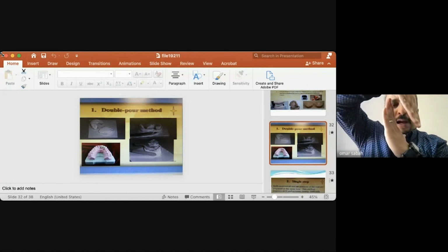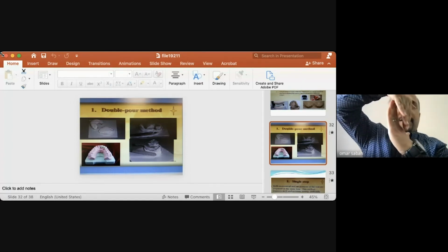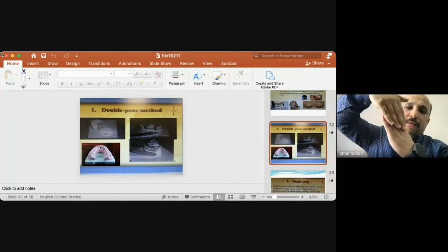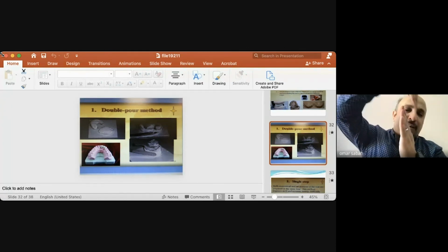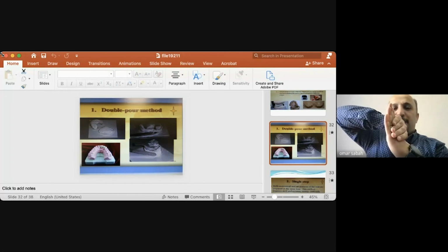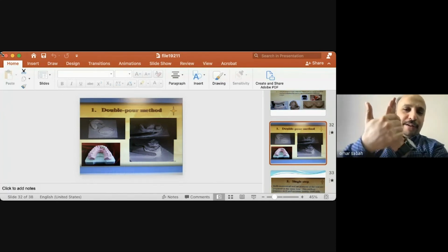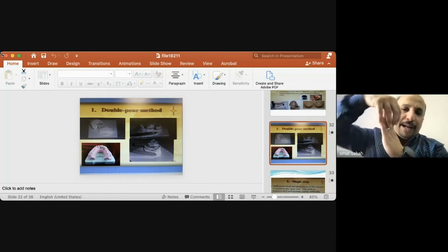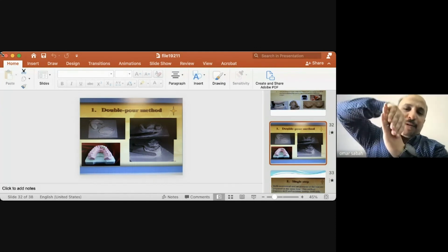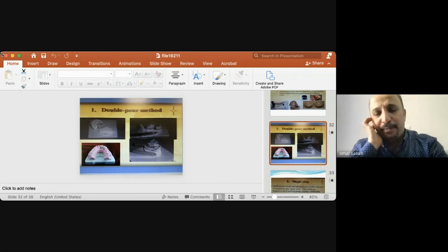راح اجيب التري اقعده هوني، شوف راح يصير عندي فراغ هوني كبير مكان هذا الفراغ الحفره تمام. الماتيريال مال سبيشال تري من راح تيجي تاخذ هاي المكان تسجله، من ارجع اريد اشيله من الرج ما تطلع اذا الماتيريال ما عنده الاستيسيتي، لانه راح تصير مثل الحفره. زين انا من اشيله من الحفره شنو اطلعه؟ ما تطلع، لانه هاي الرج من هون عاليه ومن هون عندي حفره. هتشوف. فمن الماتيريال تبس بهاي المكان ما راح اطيق اسحبه تطلع خارج. لو عندي الاستيسيتي ماتيريال مثل ربر بيس، ايش راح تعمل؟ الماتيريال هي تنكبس وتطلع وتفتح مره ثانيه، ترجع على شكل الرج اللي مسجله. هاي اندر كات.